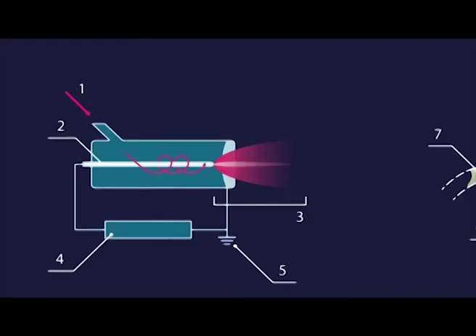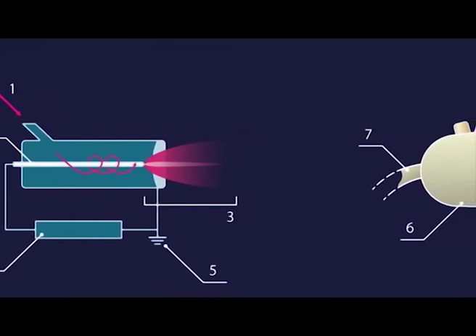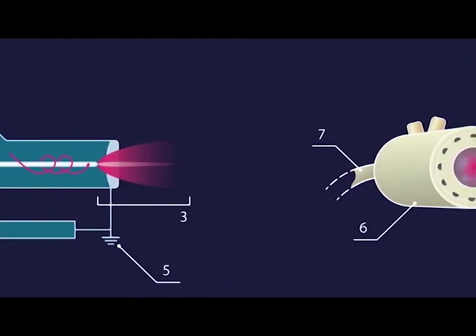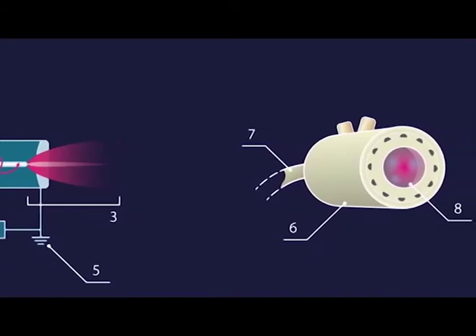Plasma sterilization. Plasma sterilization is used for thermolabile reusable medical supplies made of plastic. The sterilization medium is a low temperature plasma created in a high frequency electromagnetic field that interacts with vapors of 58% hydrogen peroxide in a high vacuum.